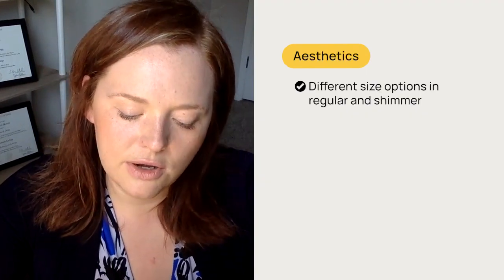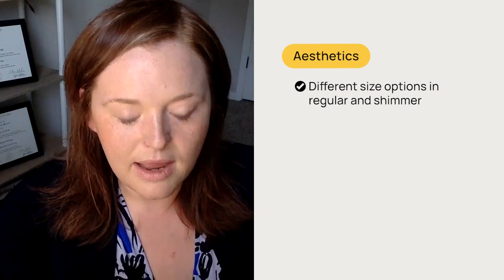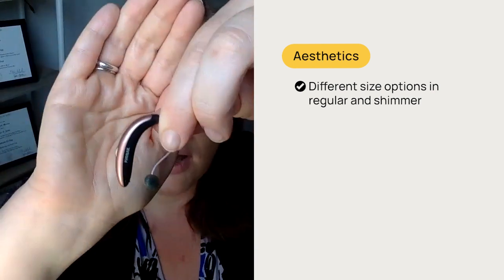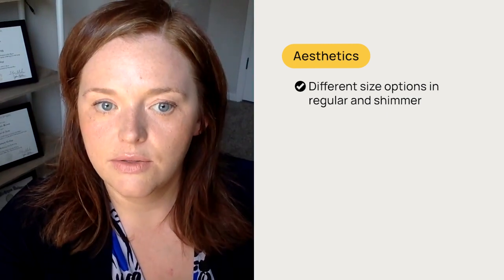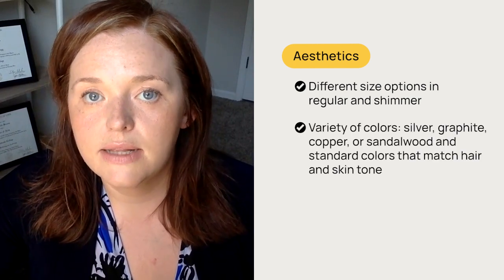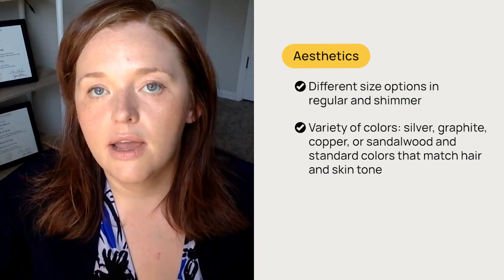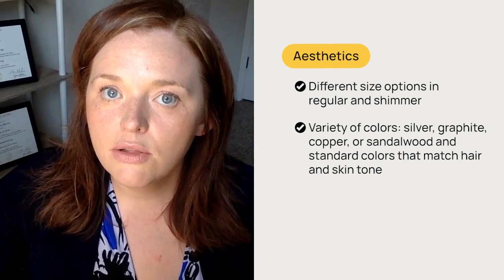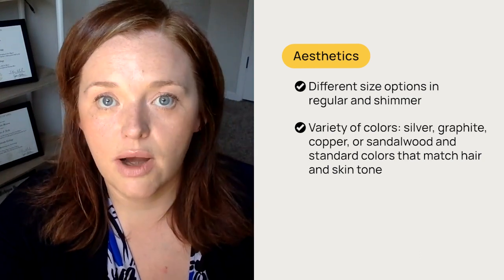When we talk about the look of it, you have different size options — I'm going to show you some of these here. So you have the standard receiver-in-the-canal — you can see that this is the standard size one. They also have a new slim product here, which you can see is slimmer compared to the other one. It comes in a variety of colors. The slim has a striped look and comes in silver, graphite, copper, or sandalwood with black. The colors for the standard one are your standard colors that go well with hair color or skin tone — some silver, gray, and brown colors.